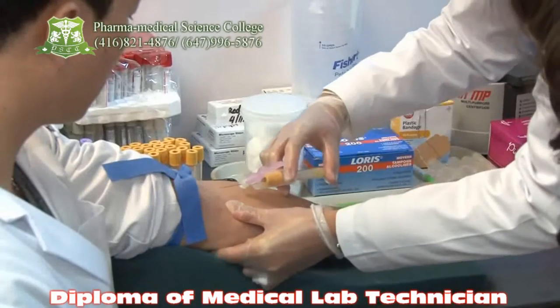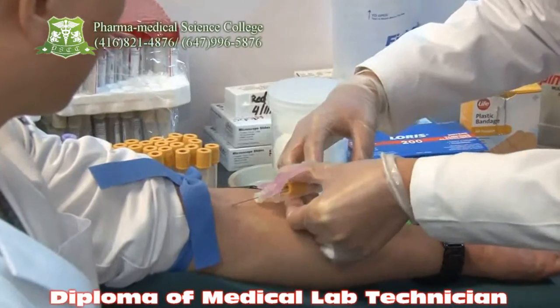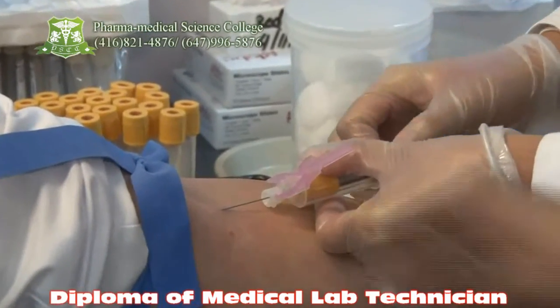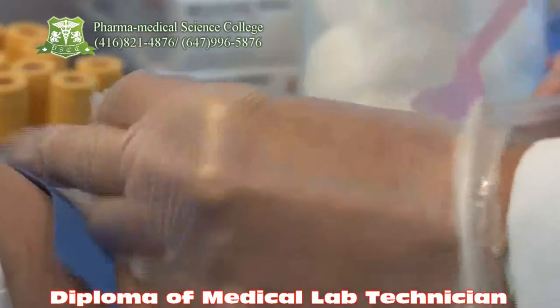Stretch the skin a little bit. Excellent. Very good. And push — you are doing fine. These students need encouragement. Very good. That's it. Cover it. Put the cotton. Excellent. And that's it.